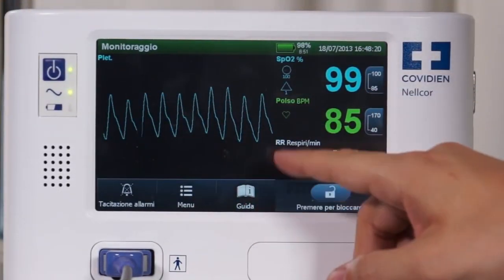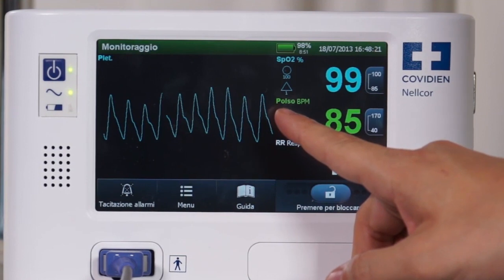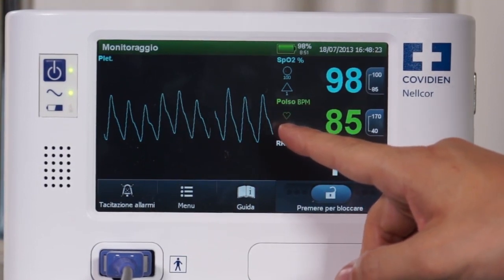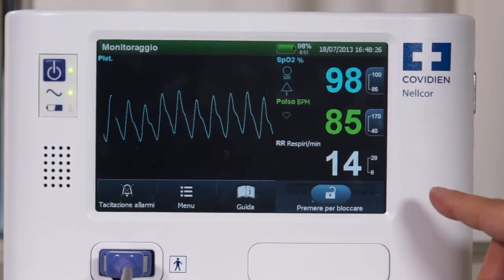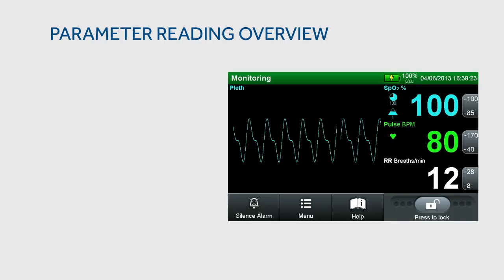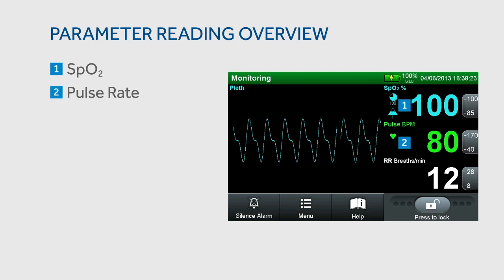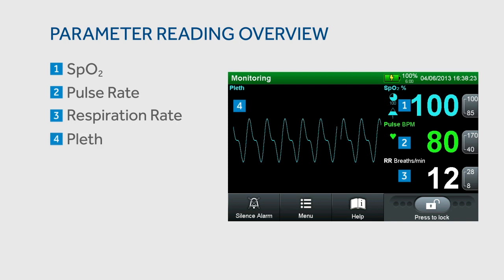All critical patient status information is displayed on the main screen, making it easy for clinicians to access the information they need from one screen rather than having to sort through many screens. The main view of the LCD display provides values for arterial blood oxygen saturation, pulse rate, and respiration rate in prominent numbers that can be read at a glance. You can also easily view the plethysmographic waveform.